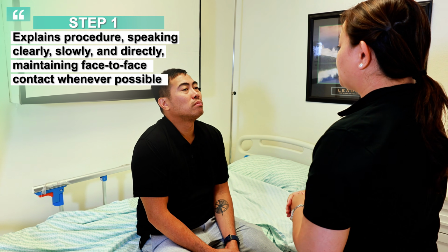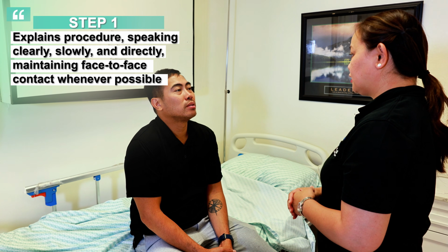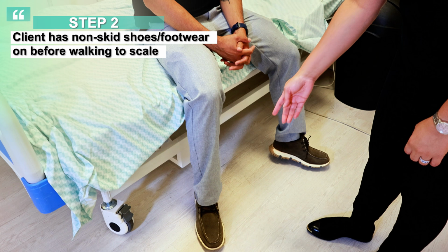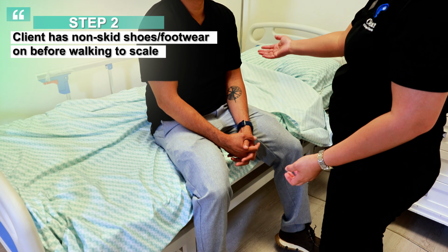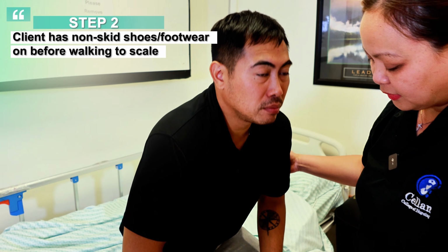Okay. I'm here to weigh you. Is that okay? Yes. And I heard you could walk. Yes. Okay. And then I noticed that you already have your non-skid shoes. Okay. So we're going to get up and I'm going to assist you to go to the scale. So stand up. Very good.